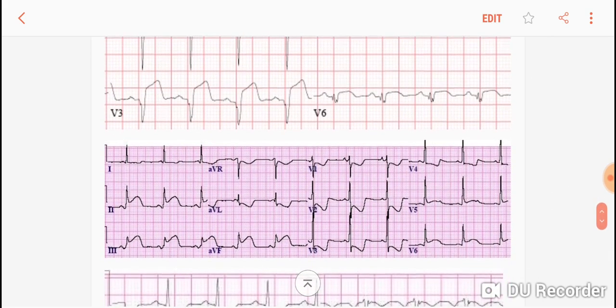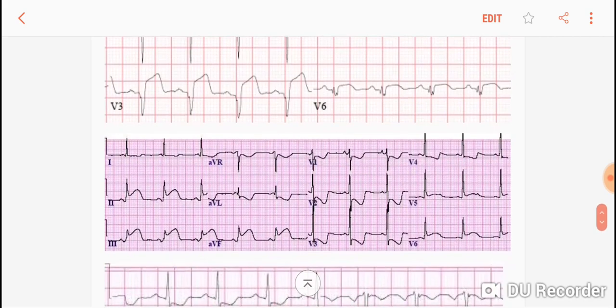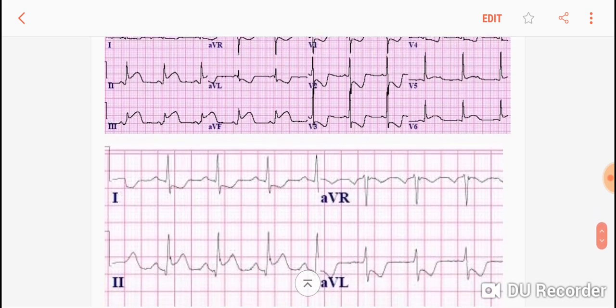In this picture, leads 2, 3, and AVF are elevated. Also, you see a very strong depression in V1, V2, V3, and V4. This means it is a posterior wall MI. You see reciprocal changes — ST depression in the anterior leads and elevation in the inferior leads. This is an example of a posterior wall MI.